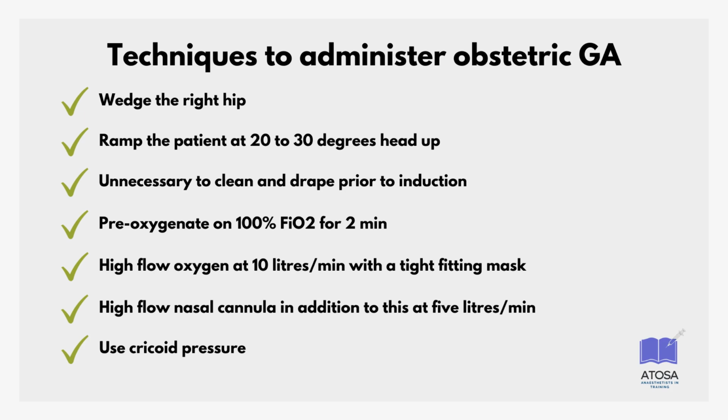I use cricoid pressure. The guideline is to use 10 newtons pre-induction, increased to 30 newtons post-induction. No one knows what this really means, but the point is always think about patient comfort and only increase pressure as the patient is induced. I maintain it until successful endotracheal intubation has been confirmed, but I have a low threshold to abandon it if I'm struggling, and I think that the cricoid pressure is contributing to the difficulty.